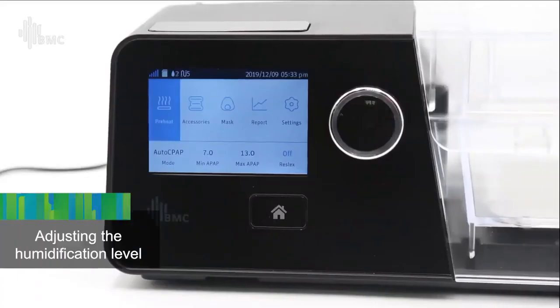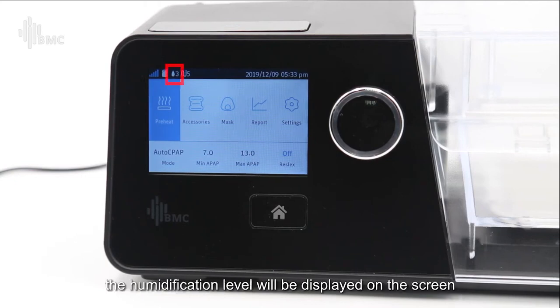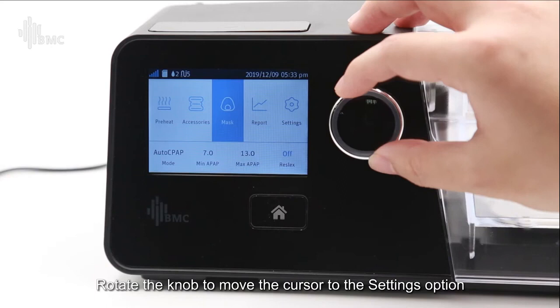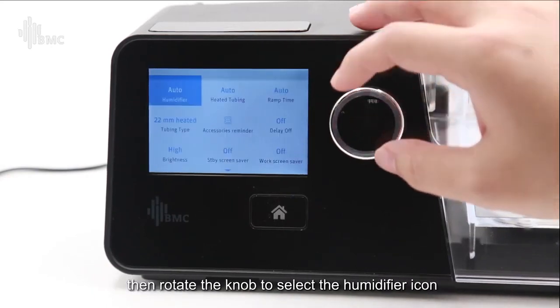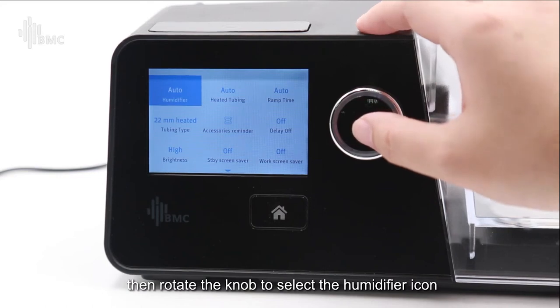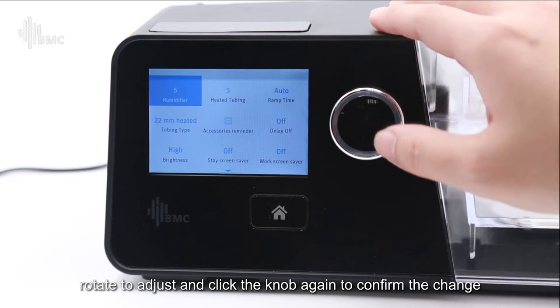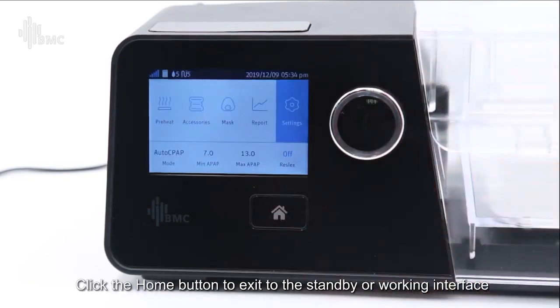Adjusting the humidification level. When the device is in use, the humidification level will be displayed on the screen. The humidification level can be adjusted in standby mode or when the unit is in use. Rotate the knob to move the cursor to the setting options. Click the knob to enter the user menu, then rotate the knob to select the humidifier icon. Press the knob to enable the adjustment, rotate to adjust, and click the knob again to confirm the change. Click the Home button to exit to the standby or working interface.